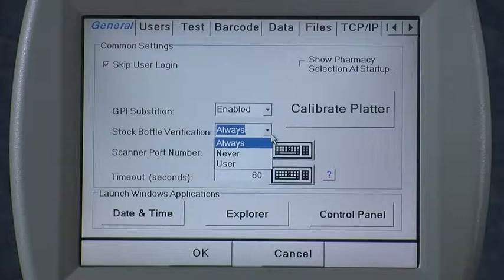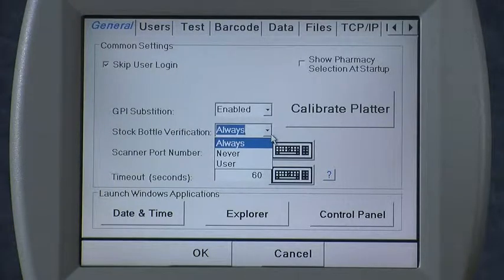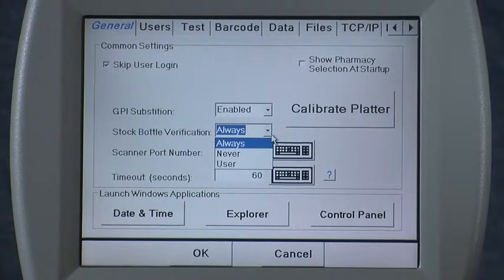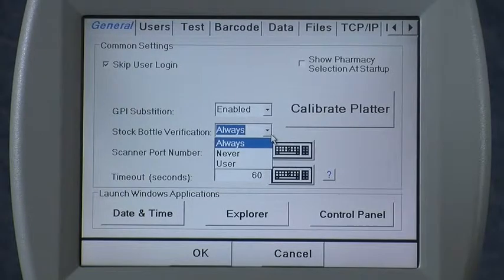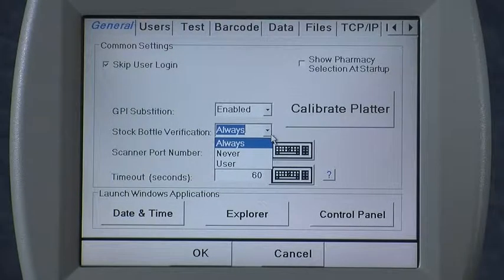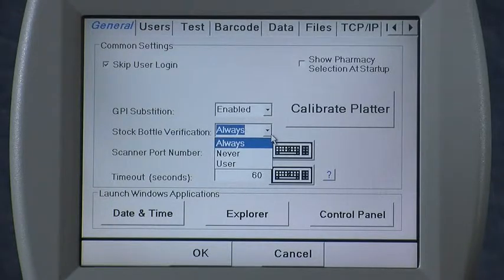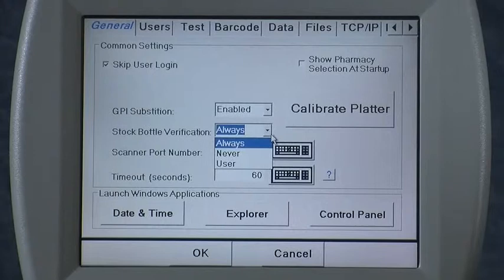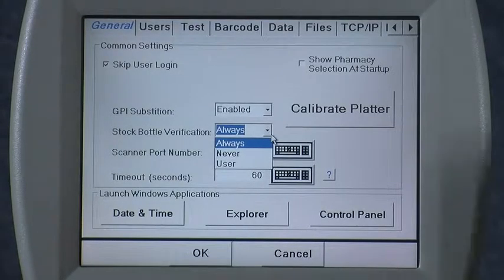Where this can be useful is if you're double counting prescriptions that have been filled in your robotic system and sometimes the stock bottle is not available. The robotic system has already verified that the right drug has been dispensed and you just want to count them on the icon. So you would scan your prescription label, skip validation, and jump right into the count mode.